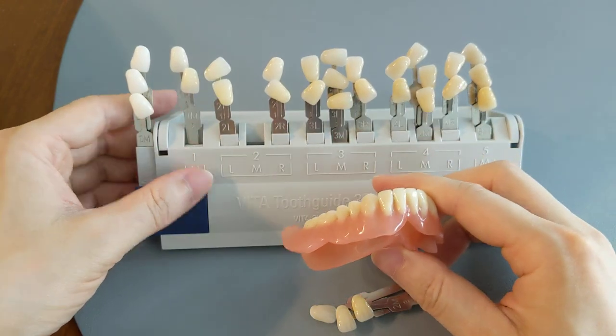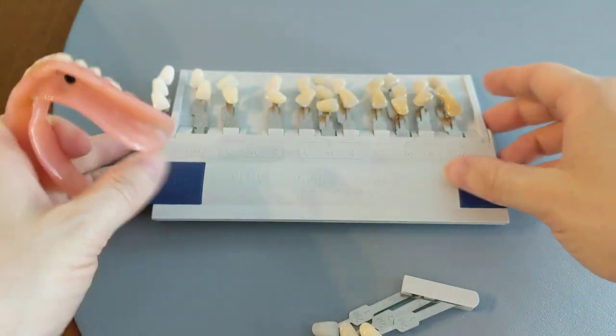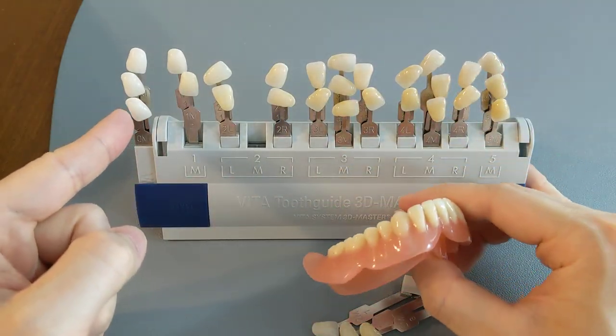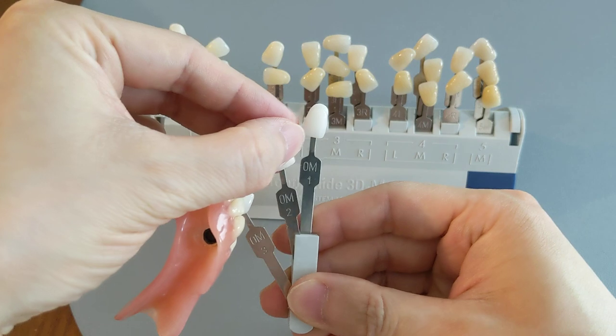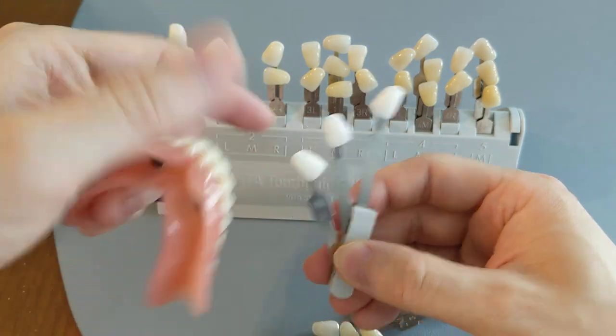So we're going to compare them to the bleach shades. All the colors from this side to there are the normal ones, and the bleach ones are the super blazingly white ones at the end here. It goes from 0M3, 0M2, and 0M1 — the one is the lightest and the three is the darkest.